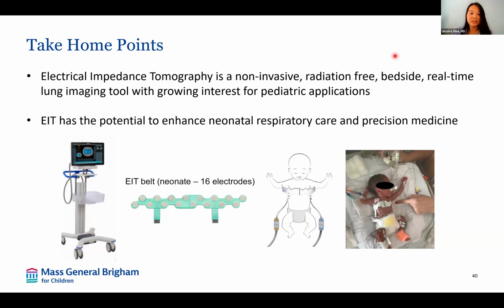Like I mentioned, that's still under research and development, and I think it will hopefully be available to most clinicians at the bedside, at least in pediatrics. My hope is that at some point we'll be able to titrate mean airway pressure, similar to what we do with PEEP, and start to see that balance of overdistension and collapse with trend reports, etc. So stay tuned for that.